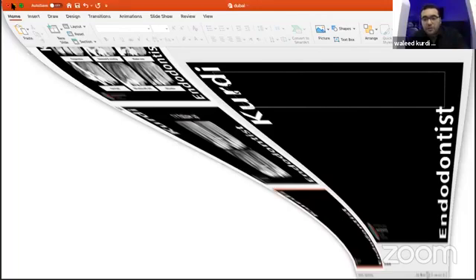How do you use ultrasonic in ledge management? As I said also, if you can only see it. How to confirm your instrument presence on the inner wall and not the outer? As I said, X-ray will help you, Cone Beam CT will help you, but even if you are not on the inner wall, you are in the outer curve, you will just try to complete your bypassing.